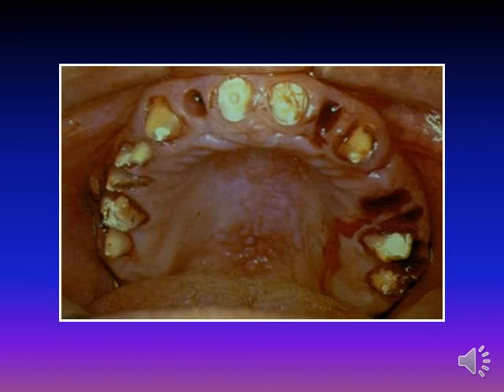The only difference is that teeth to be overlaid are contoured differently on the master cast than teeth that are to be extracted. On the day of insertion, before the other teeth are extracted, the overlaid teeth are reduced in the mouth to desired height and contour.